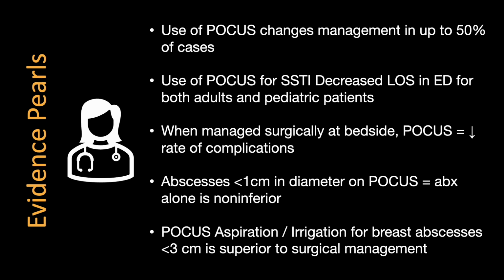Patients that receive ultrasound studies at the bedside had a decreased length of stay in the emergency room, and when performing incision and drainage of abscesses using ultrasound guidance, there is a lower risk of complications such as requiring multiple sticks or cuts, treatment failure, postoperative wound complications, and hemorrhage.